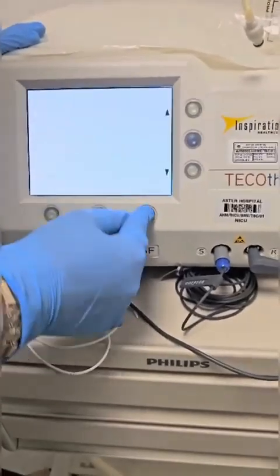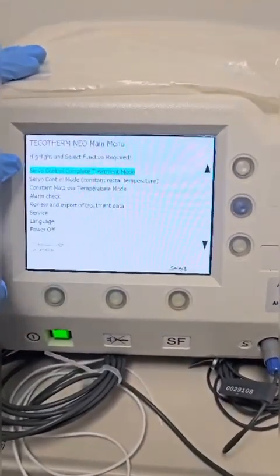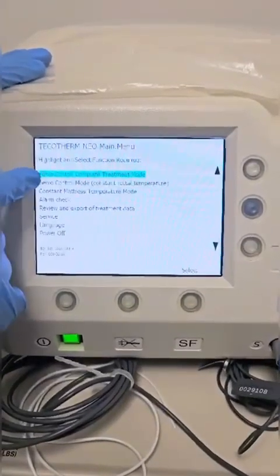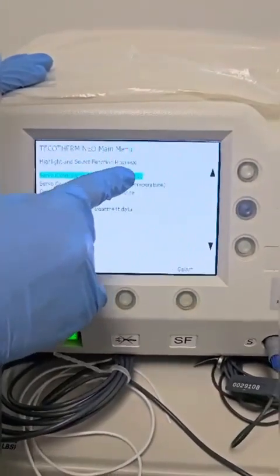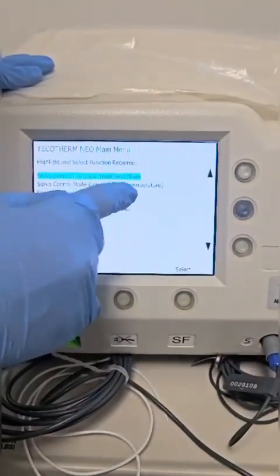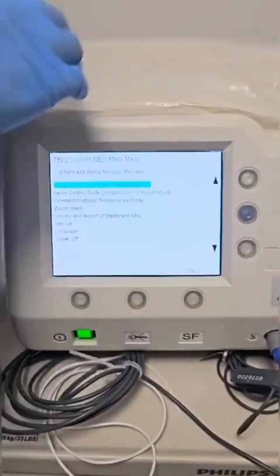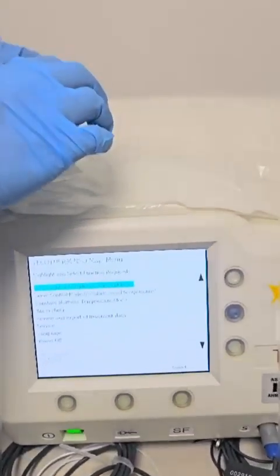So we will press yes. In the main menu you have two modes to select from. Servo Control Complete Treatment Mode is the mode that you commonly use. And Constant Mattress Temperature Mode is the mode that you usually use to fill up the mattress with distilled water.